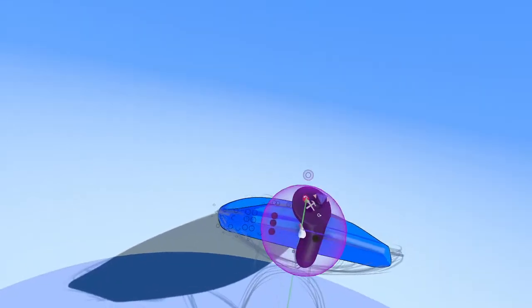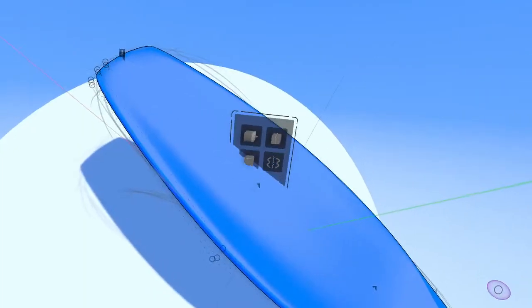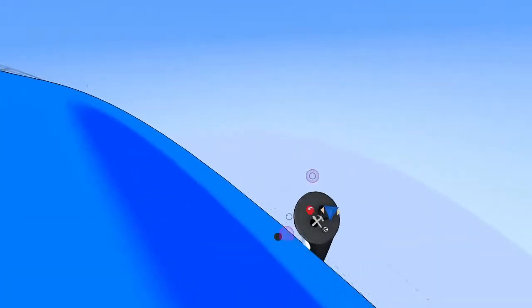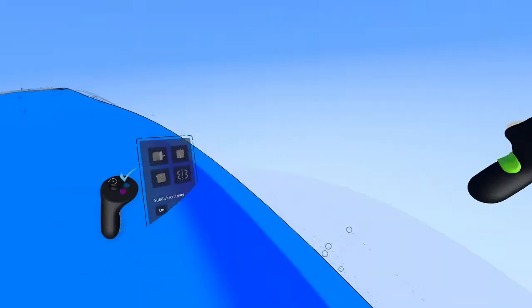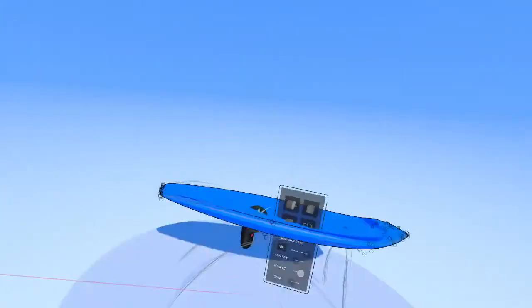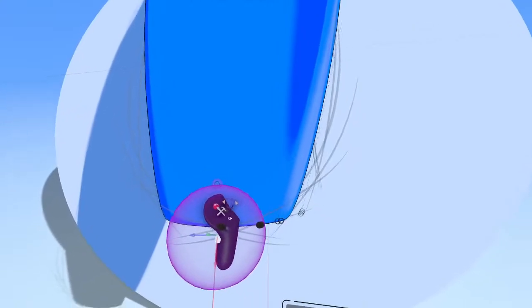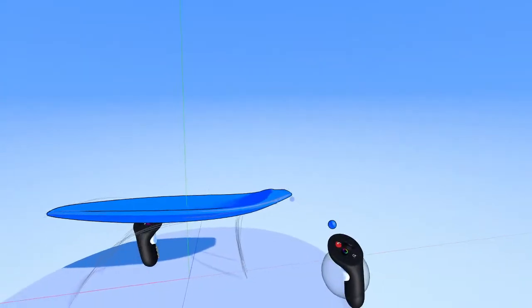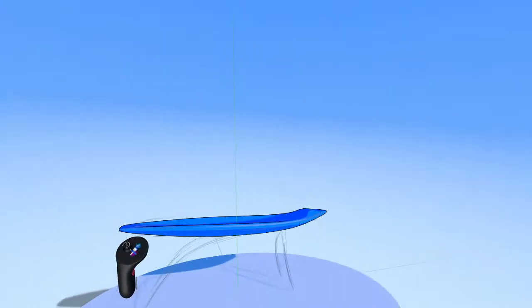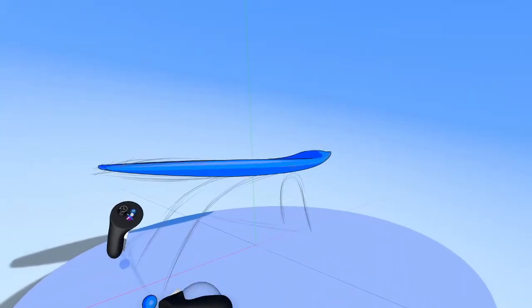All right, we're going to do a little more work on this table, just shifting some things around, and then start getting into building the robot. All right, I'll drop in a few more edge loops there and shift them around so we have some more defined radiuses or radii. And yeah, actually, this is looking really good. We can just leave this as a base layer right now. You can always come back, add to it, design it, but it's good to just leave it at that simple level right there.